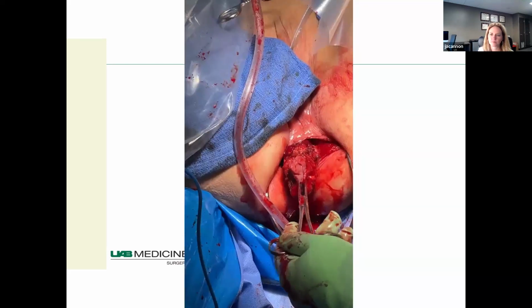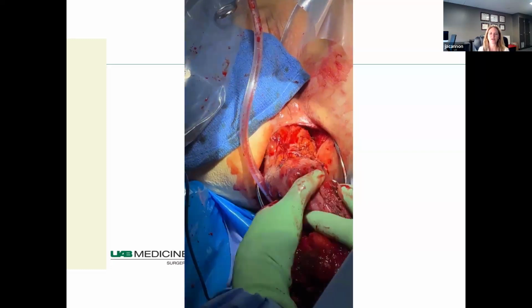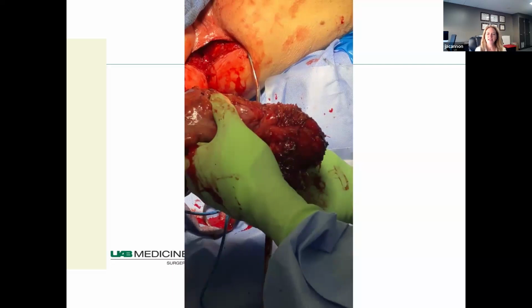dissection. And then the last video I'm going to show today is, of course, the funnest part of the operation. So here we've got Stevie J pulling the rectum out at the end of the APR. Very satisfying. And so once that's out, then, of course, you have to decide how you're going to close your perineum.